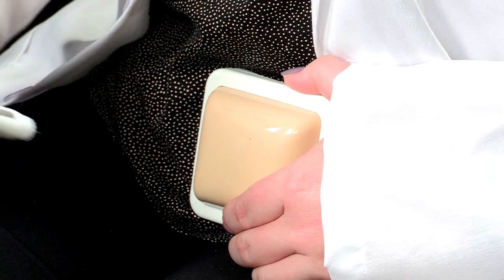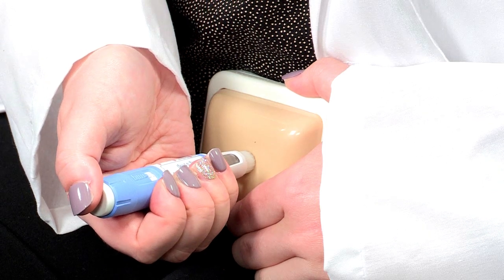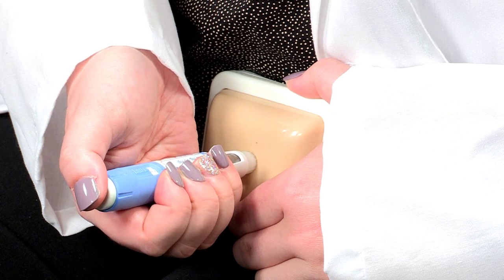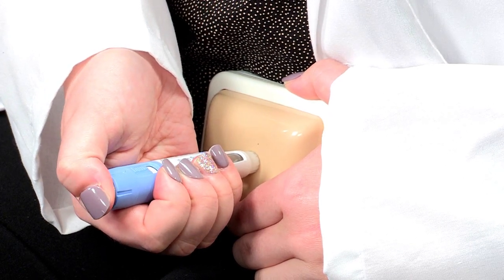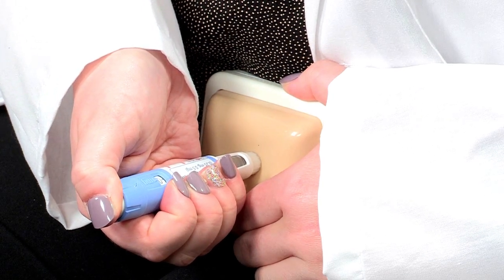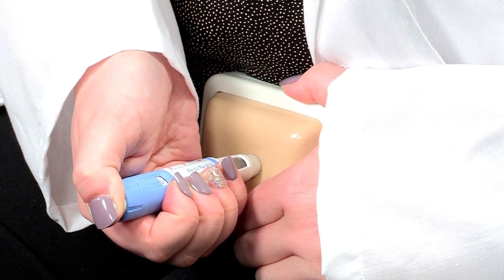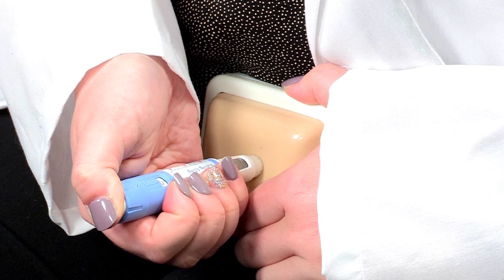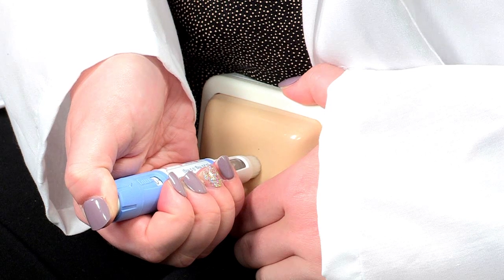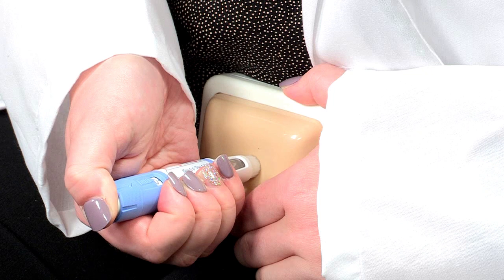Insert the needle straight into your skin — it is important to avoid injecting at an angle. Be sure you do not cover the dose counter with your finger, as this could stop the pen from working correctly. Press the dose button down and hold it until you see the dose counter move back to zero. You will then need to keep the needle in your skin with the button held down for six seconds, counting slowly: one one-thousand, two one-thousand, and so on. By doing this, you will make sure the entire dose is delivered. If the needle is removed too quickly and you see liquid come out, this may indicate the full dose was not given.